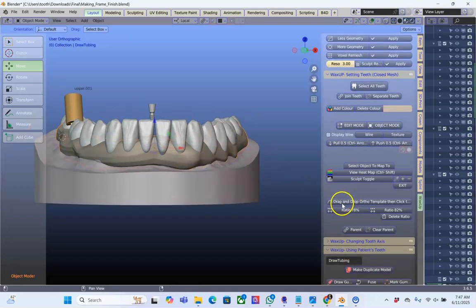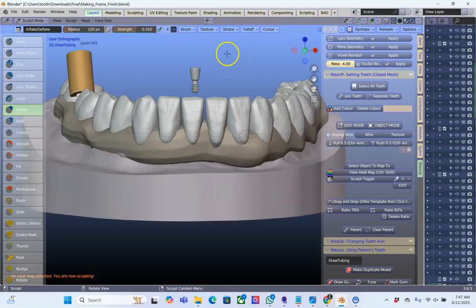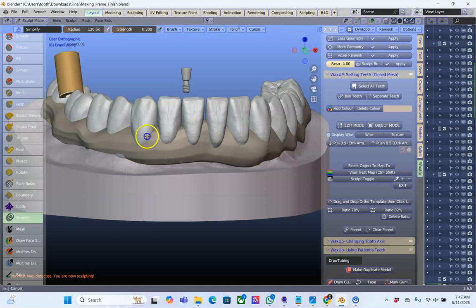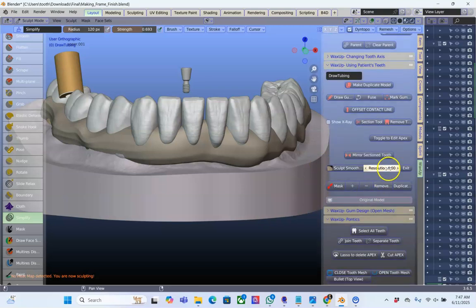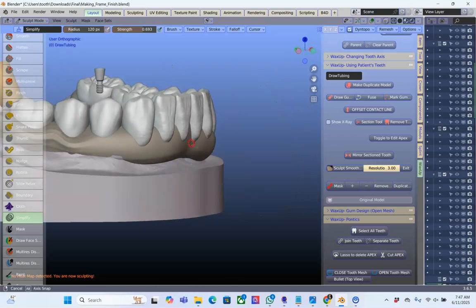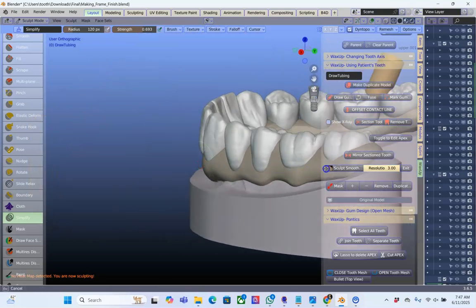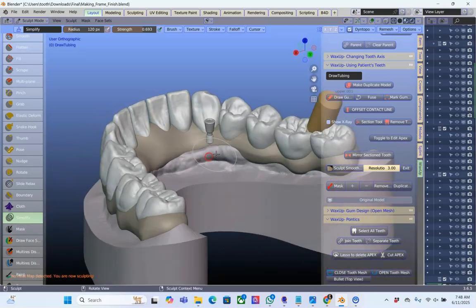Okay, now just briefly sculpt smooth this a little bit. Sculpt smooth. Oh, this is the blob tool. So this is a very aggressive tool. We're going to go into the simplify over here. Right click. I'm going to take this and make it a little bit less harsh, I think. Yeah, sculpt, make it 3. Just find yourself a resolution box. Okay, again, I'm not going to spend time on this now. I'll just briefly do an outline of it.